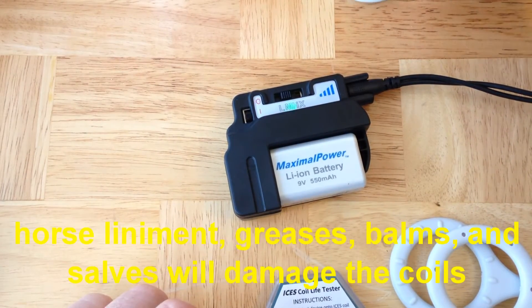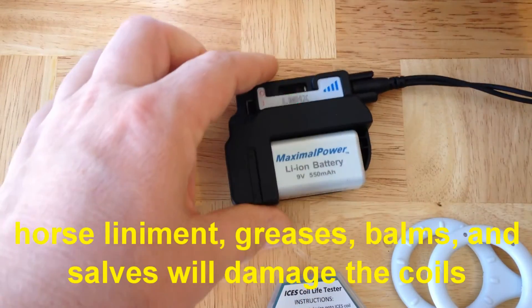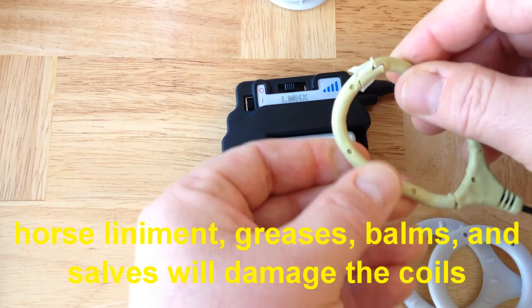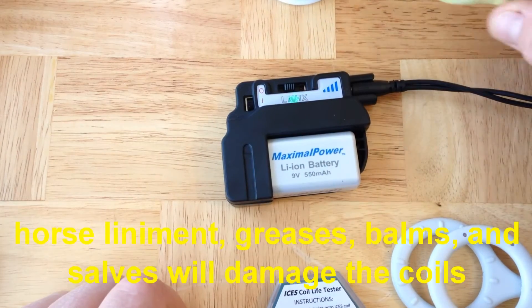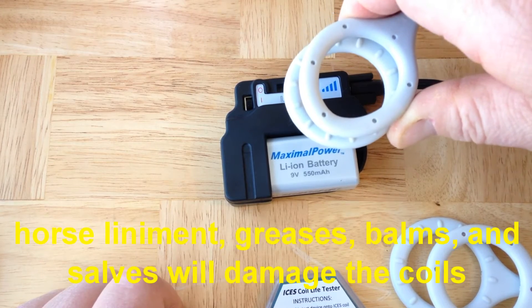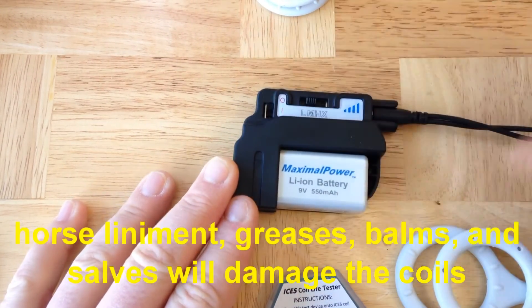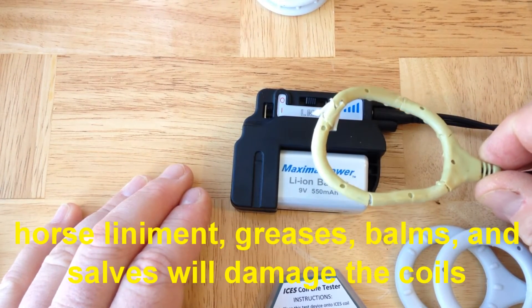If you use horse liniment, your coils will go from being nice, light gray, and very flexible — this is an older set of coils on which horse liniment was used — to cracking and falling apart. They're destroyed by greases, salves, balms, liniments, anything like that. Although your coils are made out of the highest grade available medical thermal plastic rubber, do not use any kind of grease, salve, or balm on them. Another problem is that a grease or salve may actually extract material from the coil and leave a brown ring that's visible on skin.